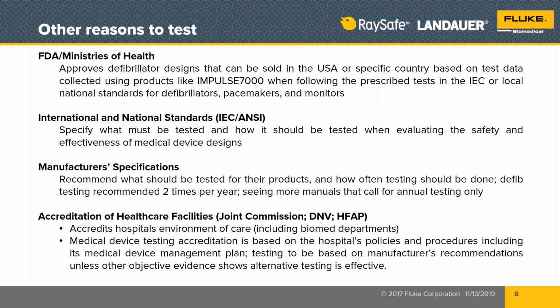And those are written for the manufacturer of the devices, and how that rolls down to the biomedical technician or engineer is through the manufacturer's specifications and the service manual test procedure, and that's brand and model specific.